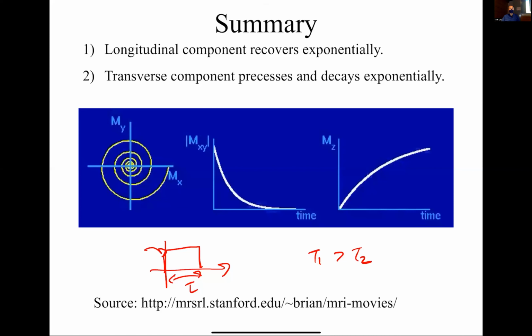But for MZ, you are referring to using the B1, then you will do it, right? But for MXY, you will start... Everything is always trying to get back to its equilibrium state. Yes, exactly. But when you're applying the B1 field, you're trying to increase the angle from the z-axis. So in this process, you're basically just increasing this angle. How in this case is the MZ decaying?